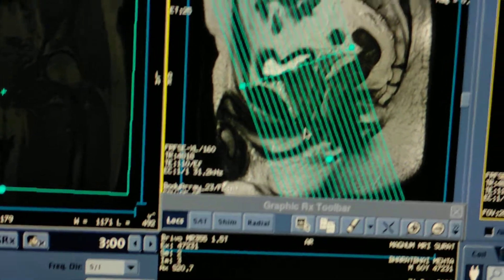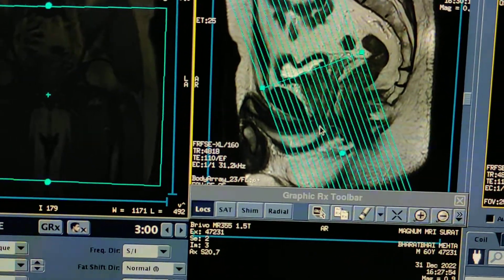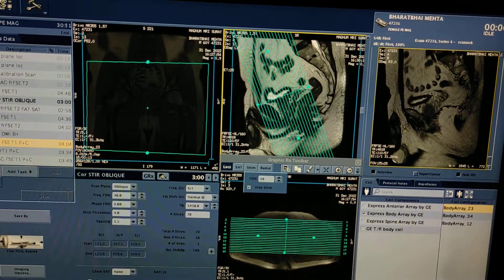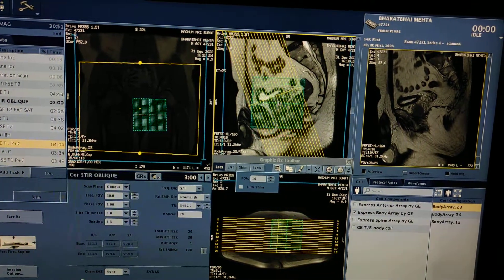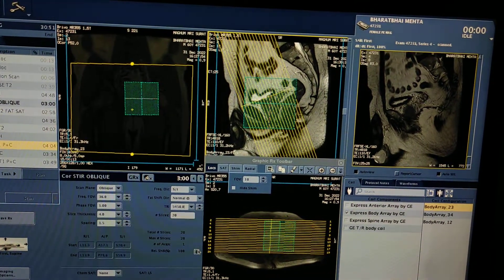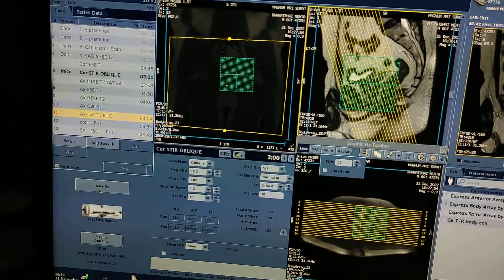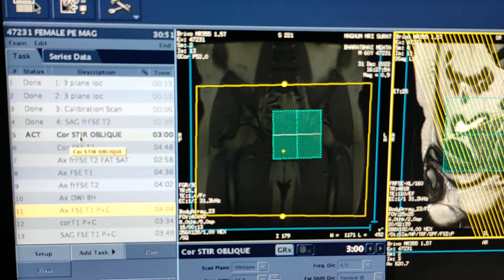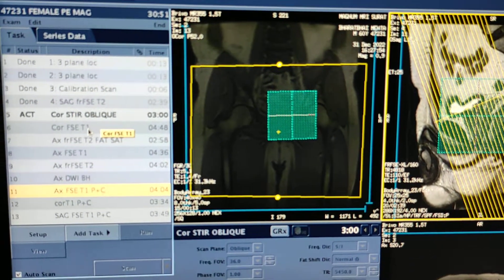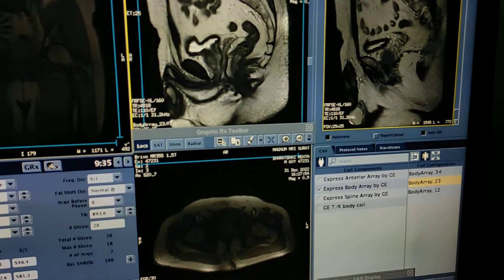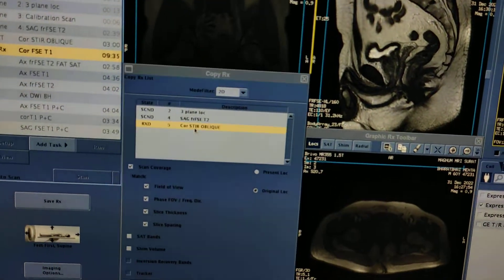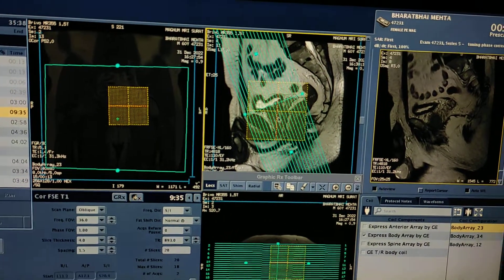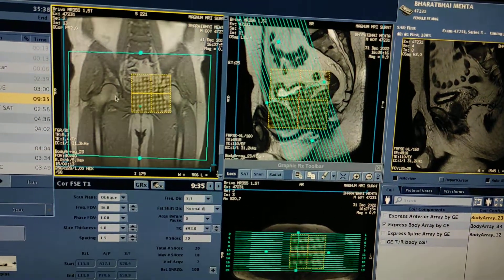This is vertical oblique — you can adjust the shim. Save and start the scan. I have given the name 'coronal STIR oblique.' Now for coronal T1, double click to open and copy from here. The same plan has been copied for coronal.